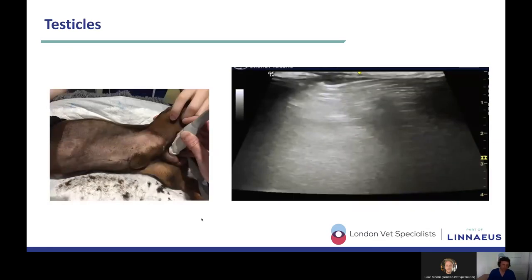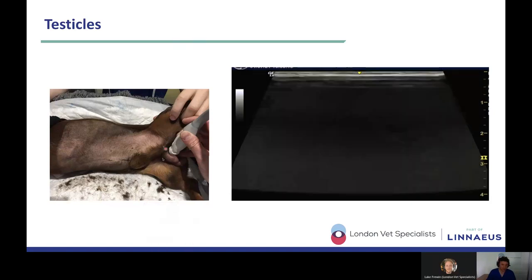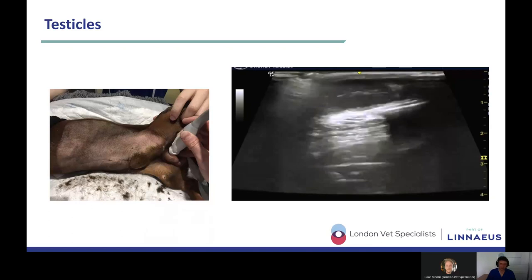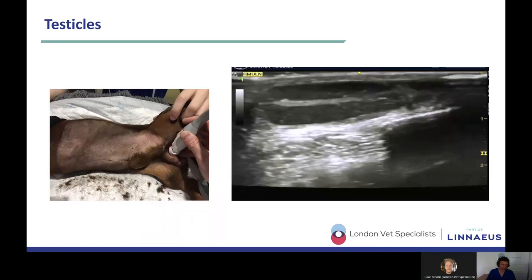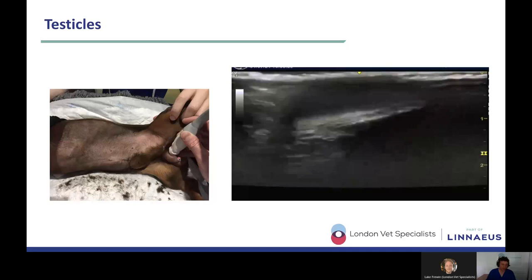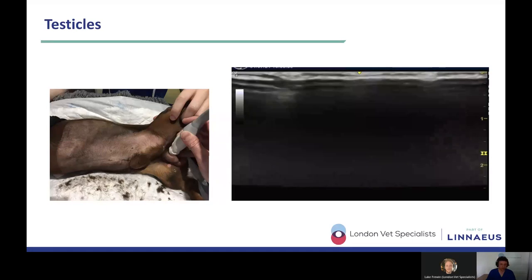Testicles are super easy, exactly where to find them. Here you literally are just popping the probe onto the testicle in order to examine it. I'd actually usually use a linear probe rather than the microconvex probe to look at the testicle. And here, just for the purposes of demonstration, I'm using the microconvex probe. The main thing about testicles is don't forget to examine them.